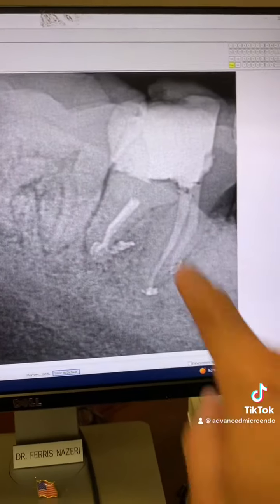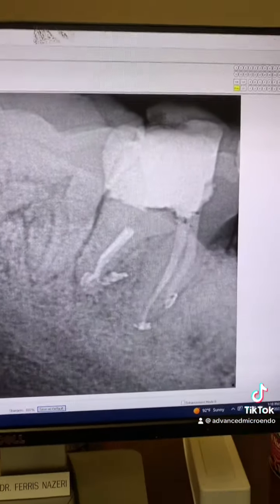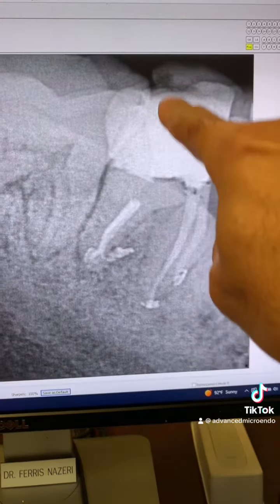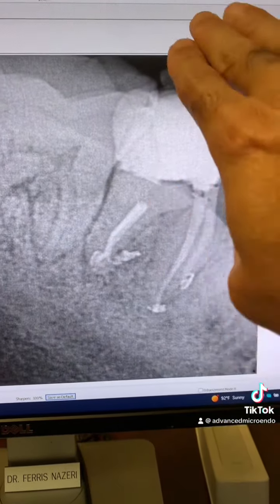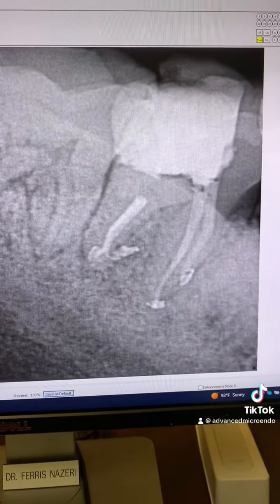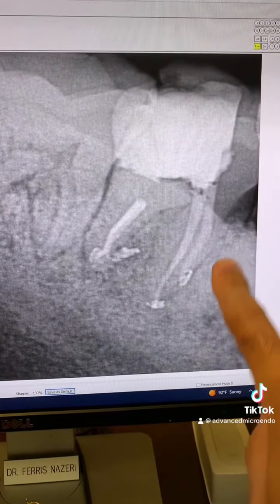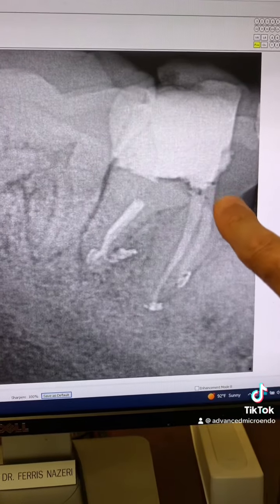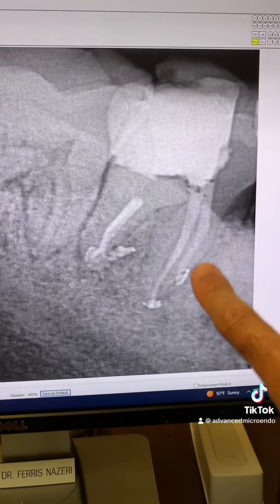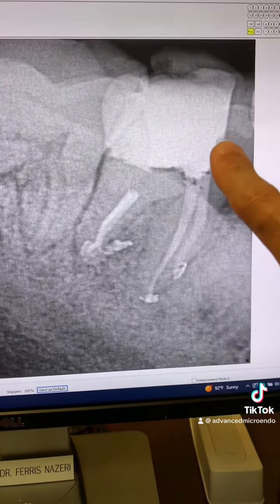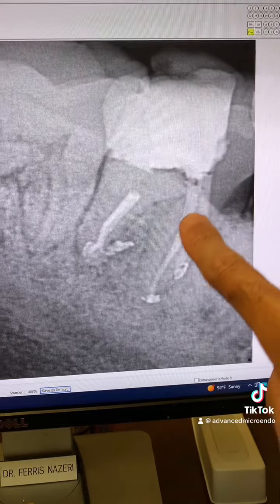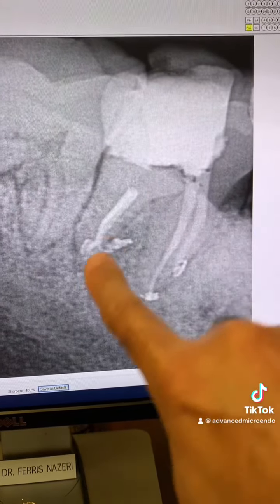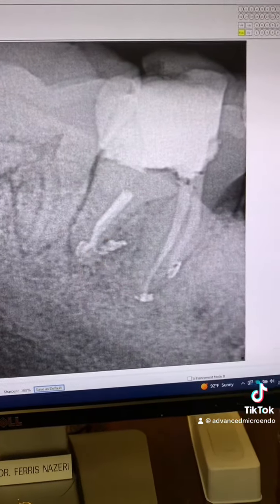Here's the post-op at one angulation. We went ahead, removed the decay, and rebuilt that distal wall with composite. This is one angulation. Mesiobuccal was 18, mesiolingual was 20, and distal was also 20.